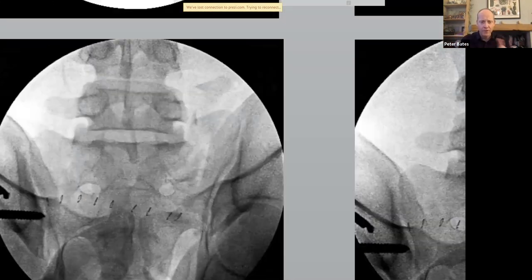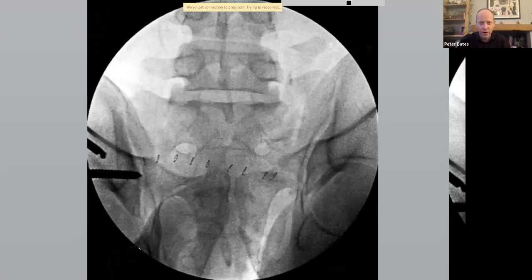Oh, hang on a second. What about the outlet view? Sorry, rewind. Okay, what have we got on this view? Same thing. You've got that displacement. This is the normal side, like that. This side, it goes burp, and then stops, and then restarts again up there. See that? What's this guy up here? Who's this dude? What is that? That is actually the equivalent of this guy.